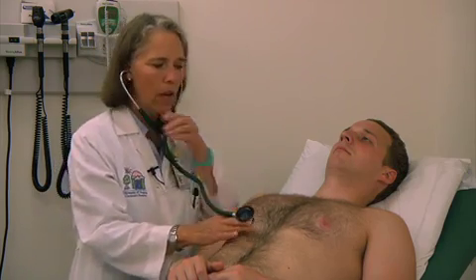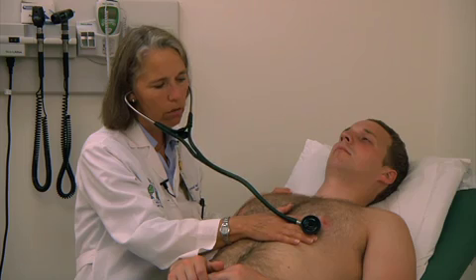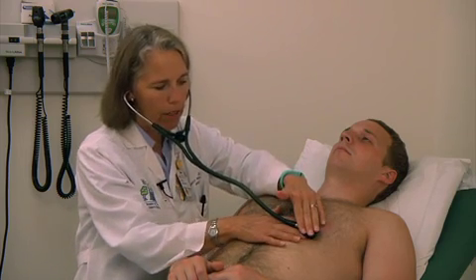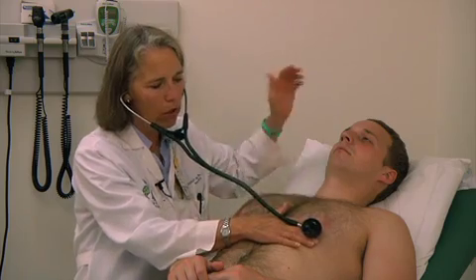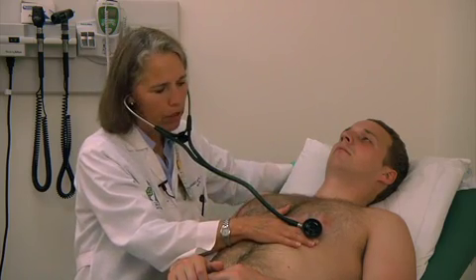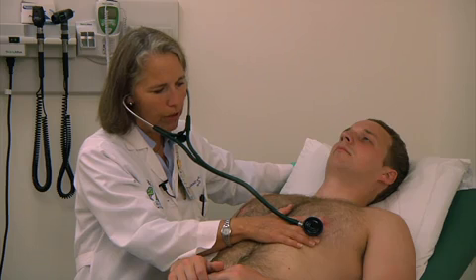Then typically what I do is I turn the stethoscope over, so I'm going to use the bell now. And the bell you apply lightly. You want good contact with the chest, but if you press it down firmly, it becomes a diaphragm. So you obscure those low-pitched sounds again. So I hold it kind of with my 2 fingers and make it pretty steady, but not tight.